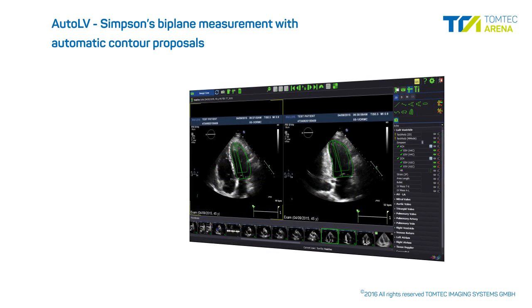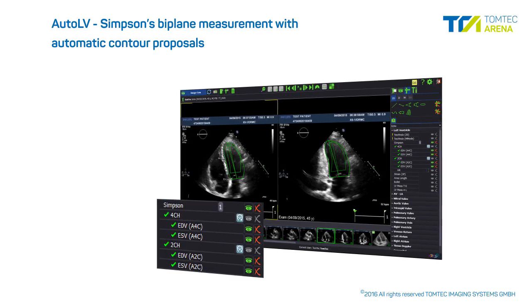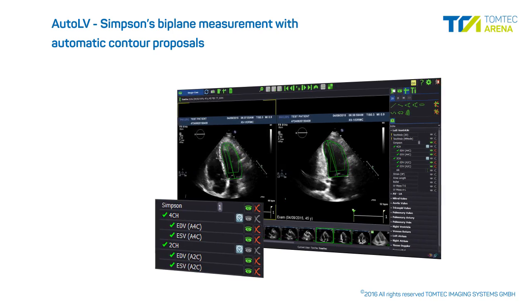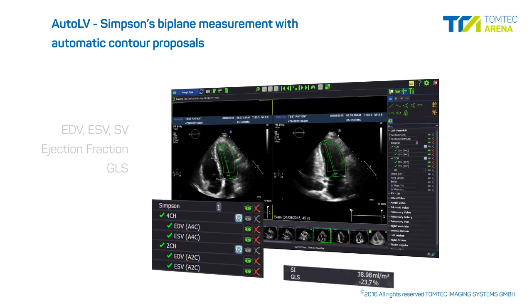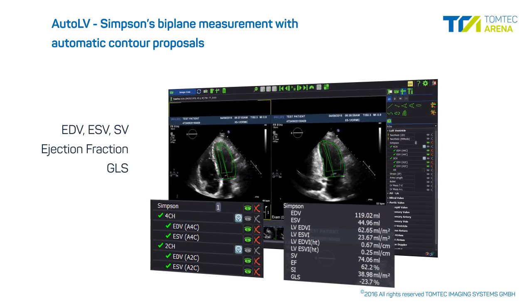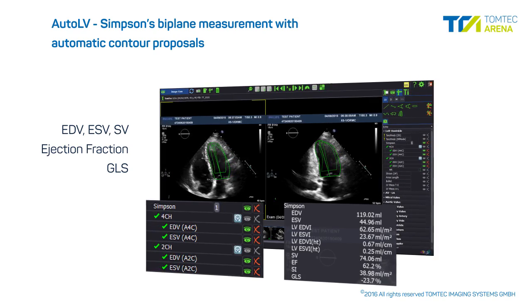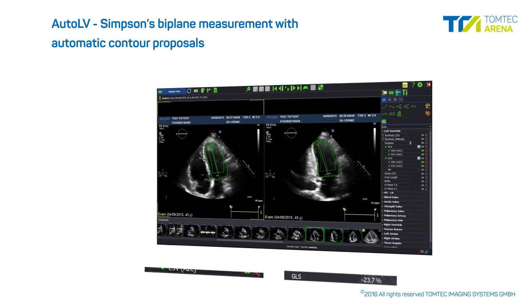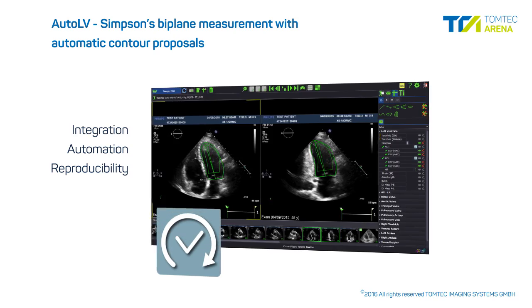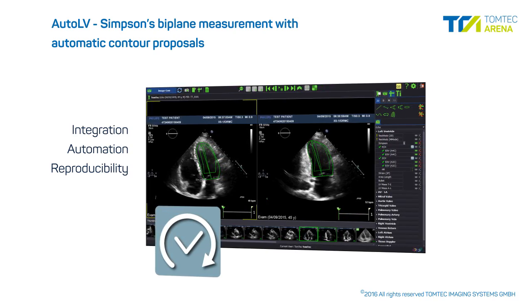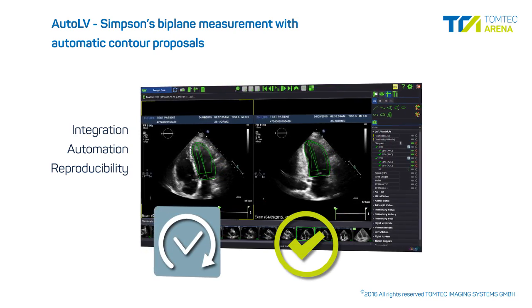The AutoLV module features an intuitive Simpsons biplane measurement with automatic contour proposals for volume, ejection fraction, and global longitudinal strain assessment. Seamless integration combined with automation allow for very rapid analyses and exceptional reproducibility.